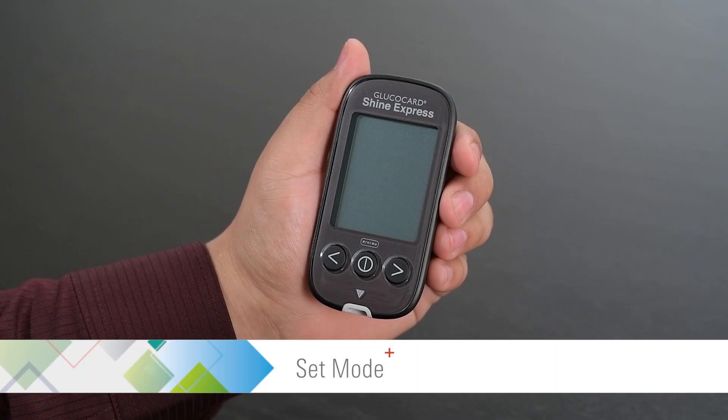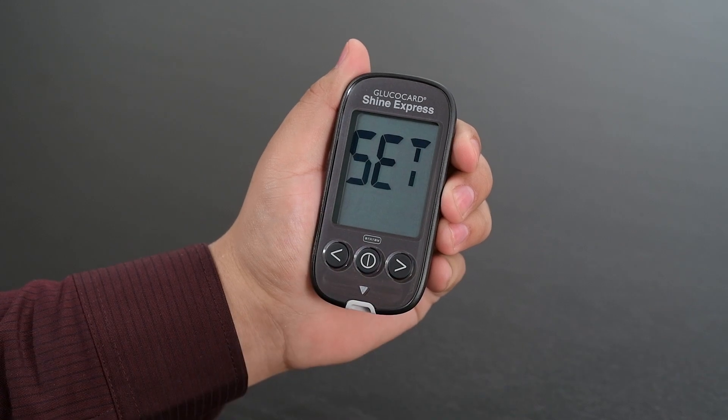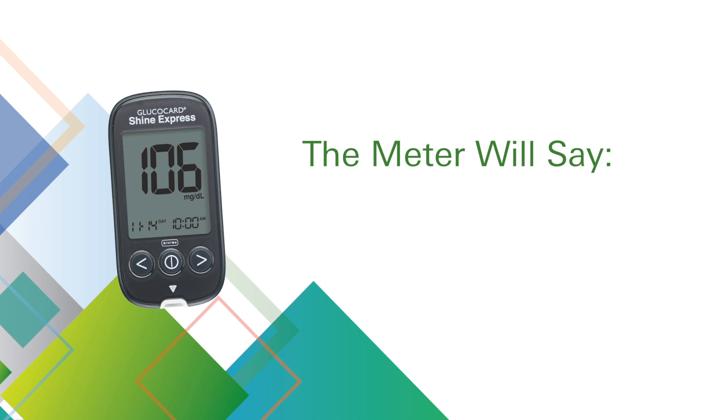To enter the set mode, press and hold the center button for three seconds until 'Set' appears on the screen. The meter will say: Set Meter.